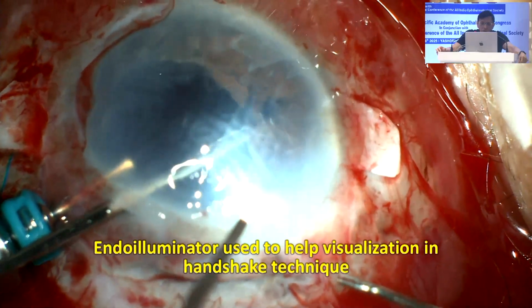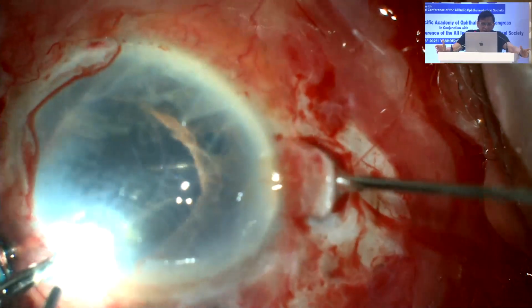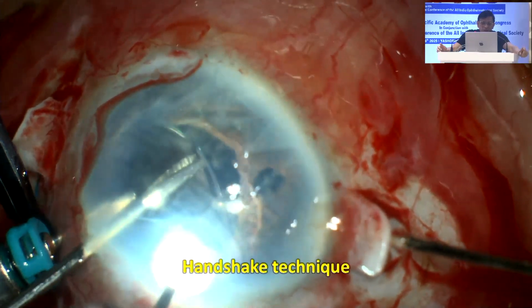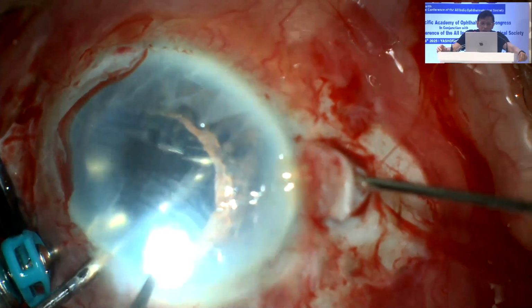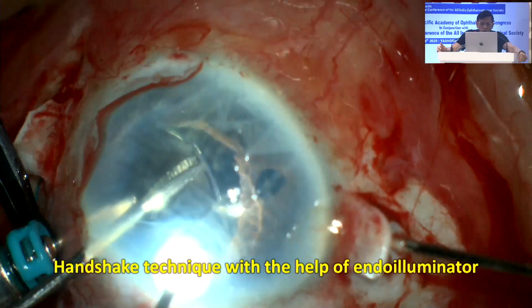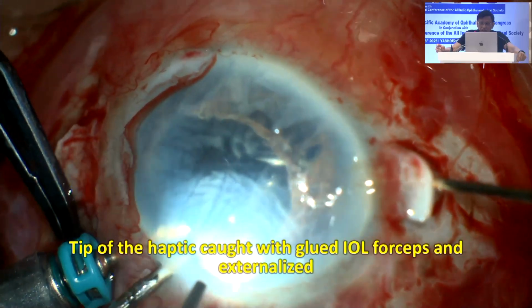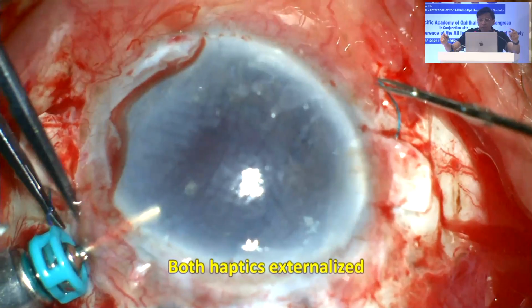Once I brought both the haptics out, you see I've transferred it from one hand to the other. It's very hazy, the view. But the beauty of the glued IOL is you can still manage with someone using an endoilluminator from outside, and you can see how I'm shifting it from one hand to the other through this very hazy, bad cornea. But still, I'm catching that haptic and externalizing it. Okay, so far so good, case not over. Now I have to repair that iris.